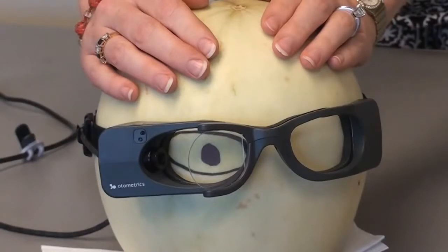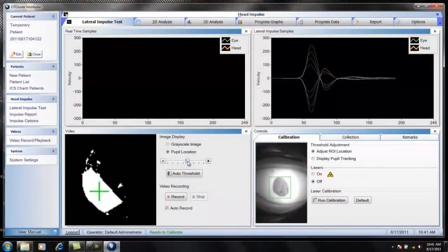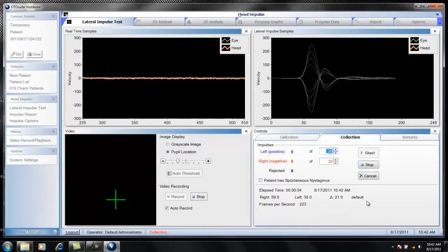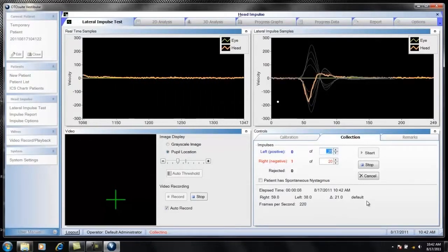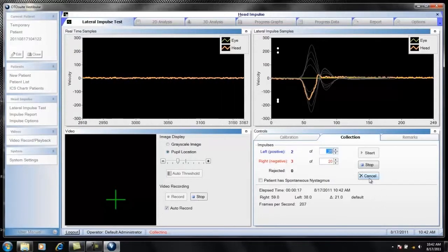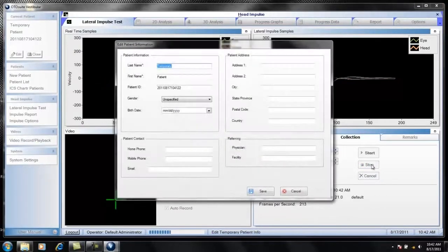If you have never done head impulses before, you are going to need to practice. It is best not to practice on the patient. You can be creative — get a melon from the grocery store or use a ball. Set up the ICS Impulse system so that it does not track the eye at all: slide the auto threshold over so it's not picking up any noise, click default for the calibration, then practice your head impulses on your fictitious patient and see your head impulses in the lateral window screen. Don't be alarmed if very few head impulses analyze, because the analysis algorithm looks at both head movement and eye movement — so many practice impulses will be rejected since there's no eye movement.